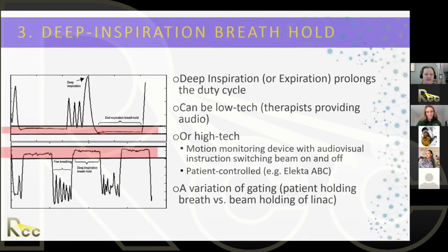The exhale has the advantage that it's a relaxed position and you have very little uncertainty in the reproducibility of the position because all your muscles are relaxed. Inhale tends to have a little bit larger uncertainty because when we inhale, we tend to tension our muscles at different positions, and you can play around with that at home.